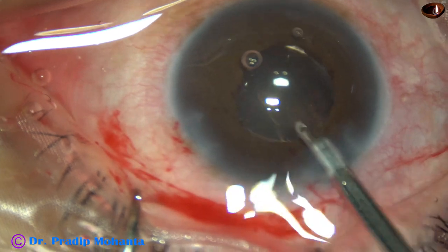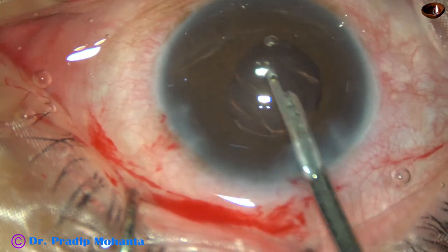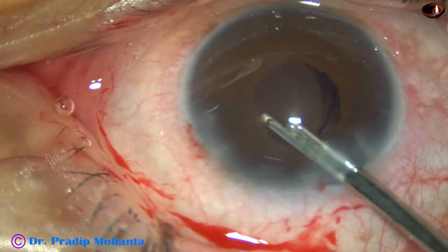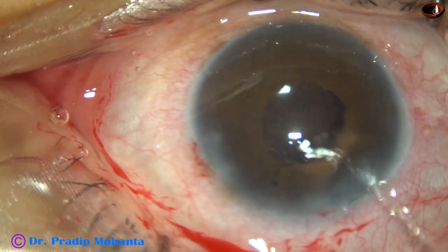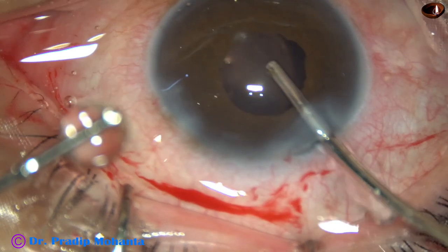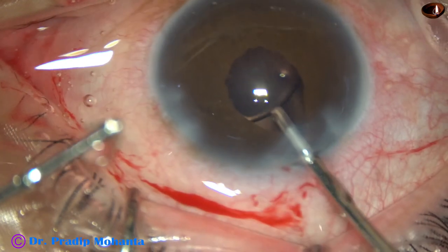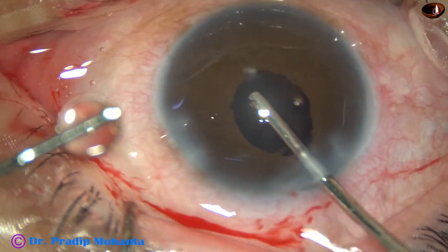Now the viscoelastic substance — in this case 2% HPMC — is nicely cleaned with the help of a 23-gauge Simcoe cannula as well as with bimanual irrigation-aspiration. Go behind the IOL and irrigate the capsular bag.